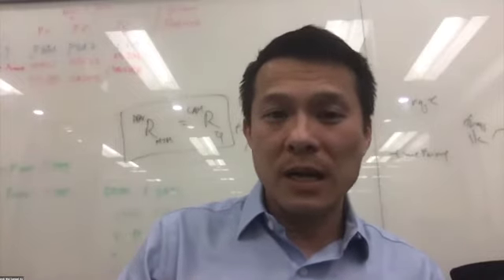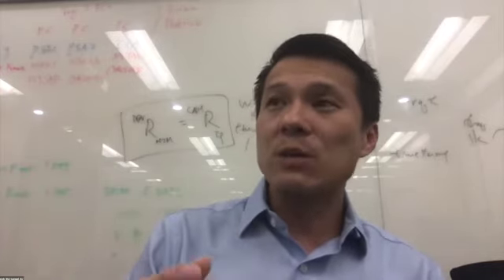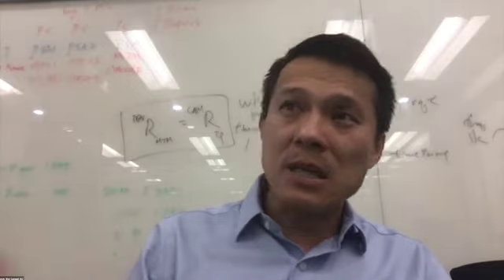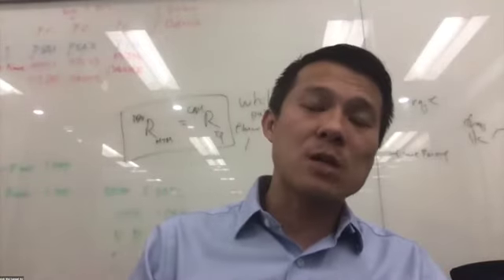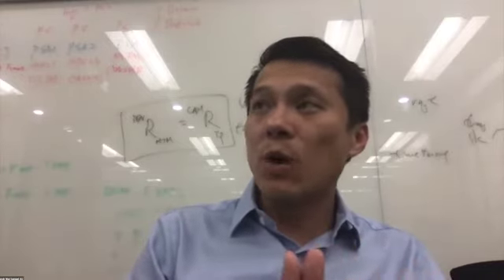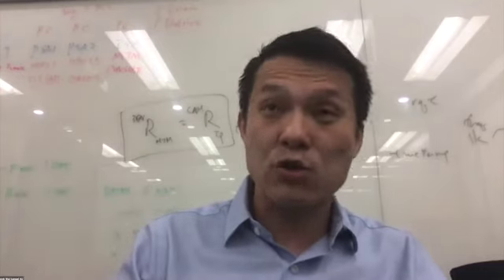For example, why we picked autonomous retraction: we think retraction by itself is a simple task and also a tedious task. If we can introduce some automation there, it will save a lot of time from the surgeon and a lot of conscious effort from you guys. Then you can focus more on the most important task in the surgery. Some of our group are also working on autonomous suture using the da Vinci robot. That is another subtask we can think of if we want to speed up the procedure. At some point, I believe many good surgeons like you can do everything by yourself. The question is whether we want to automate some tasks and give you more time to focus on something more important. That is the benefit we can provide by bringing more autonomous technology into surgery.